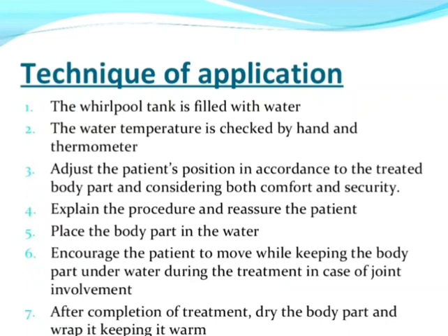Now the technique of application is very simple. The Whirlpool tank is filled with water. Water temperature is checked by hand and thermometer by the therapist, and then we adjust the position of the patient in accordance with the body part which is to be treated, and we have to consider both the comfort and the security of the patient.